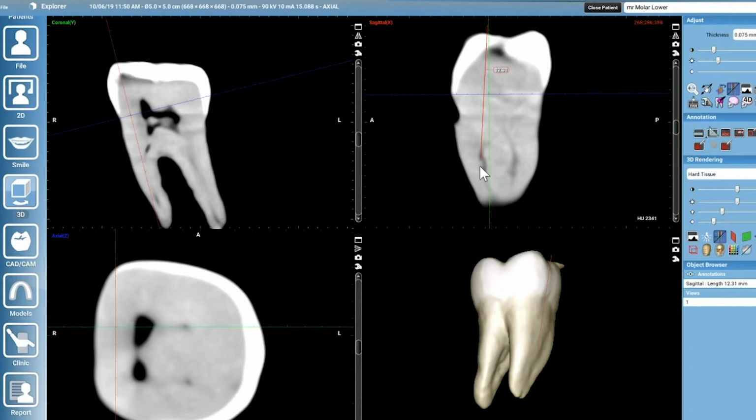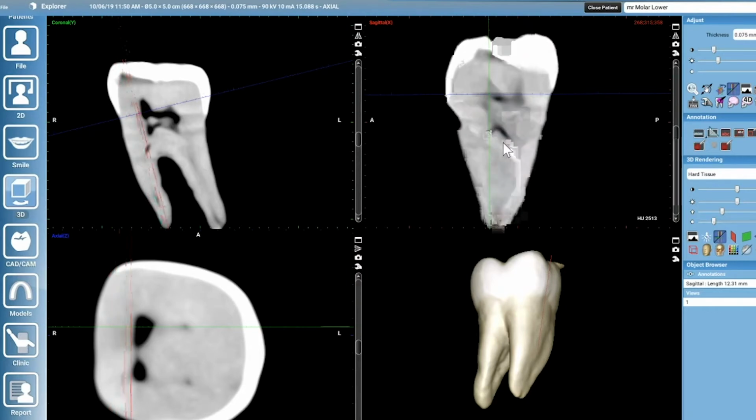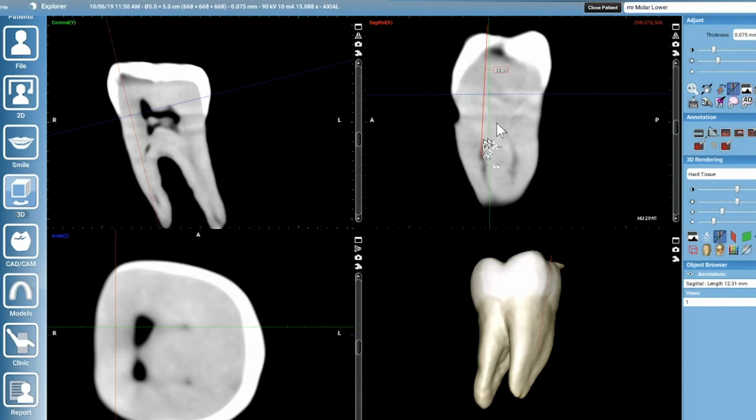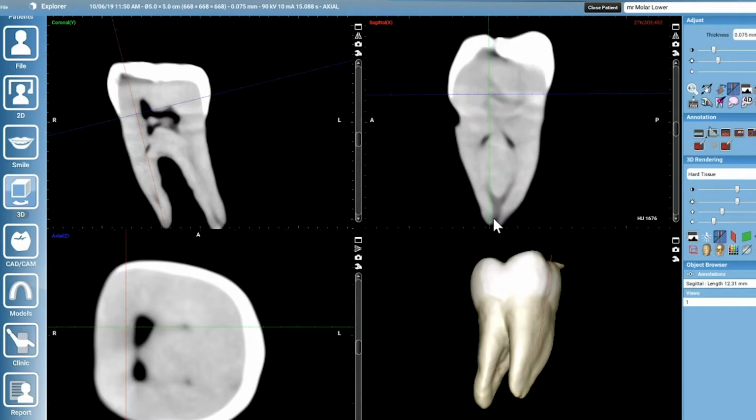So okay, once I realized that was what we were facing, I came up to the axis, shaped up a little bit straighter, a straight line axis without removing excessive pericervical dentin in this area, and then pre-bent my hand file. So this is a lingual buccal. Pre-bent the hand file towards the buccal, so coming down the lingual but bending towards the buccal, slid past that little blockage and managed to get down to working length quite easily.